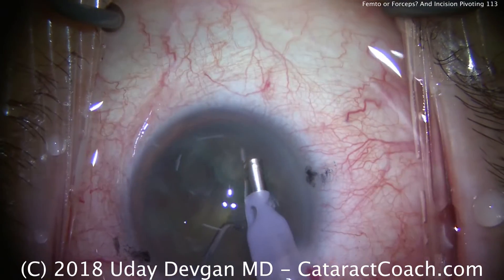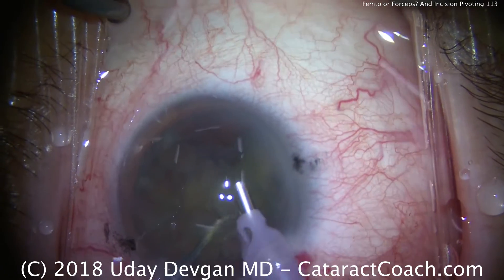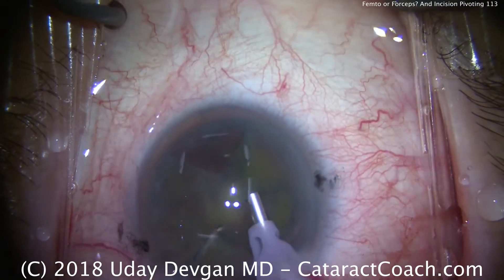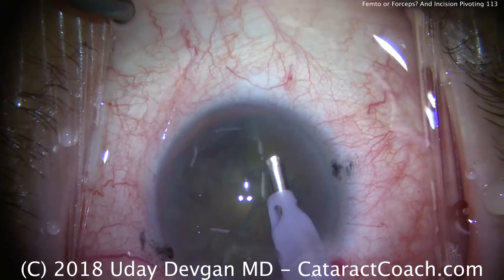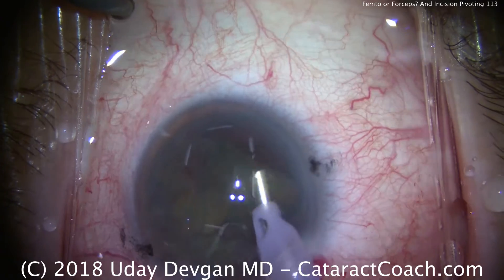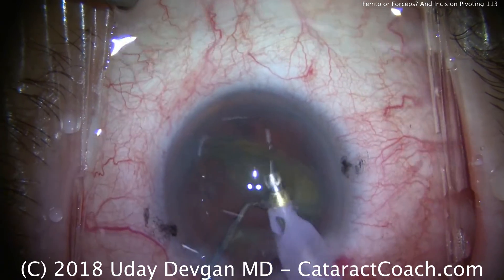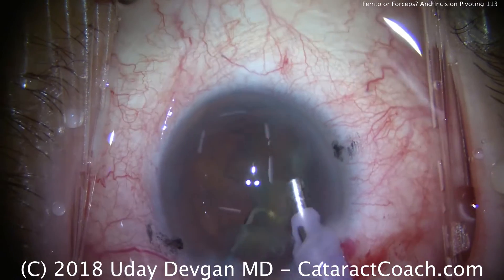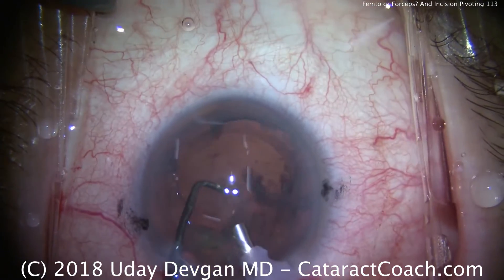Throughout all of this, we keep the eye in primary position. Those lights on the center of the cornea stay on the center of the cornea. There are only a few exceptions where we'll get the eye out of primary — one would be taking out sub-incisional cortex using the I/A probe, or if there's a nuclear chip very close to the main incision or paracentesis. But otherwise, we want to pivot in the incisions and keep the eye in primary for basically the entire case.